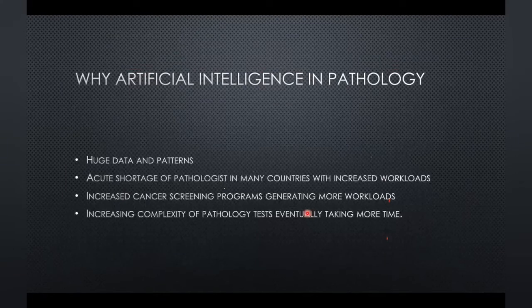So why do we require artificial intelligence in histopathology? If you look into histopathology, it's a huge amount of data. Data in the sense that it is a picture, a huge picture which has multiple pixels in it, and there are a lot of patterns in it. Anybody who does histopathology big time will fully understand there's a pattern by which you always give a diagnosis. And of course, in some countries, there is an acute shortage of pathologists with increased workloads.